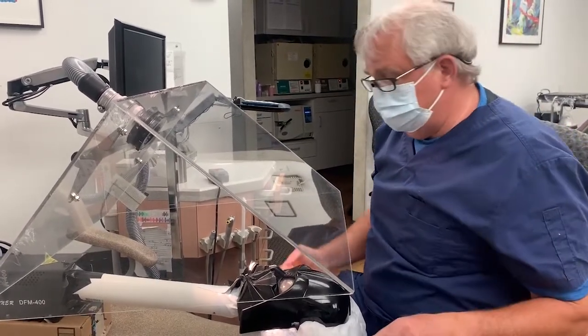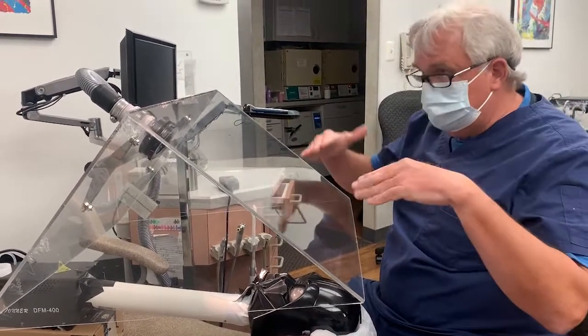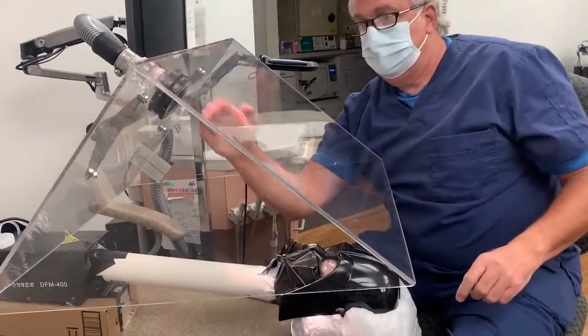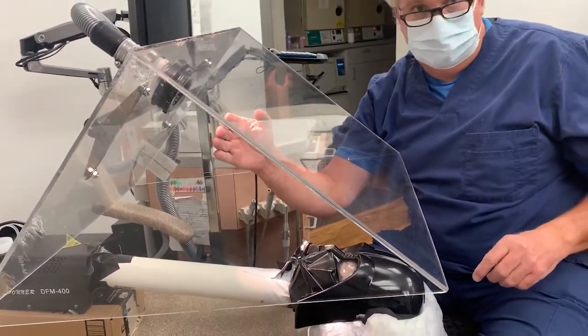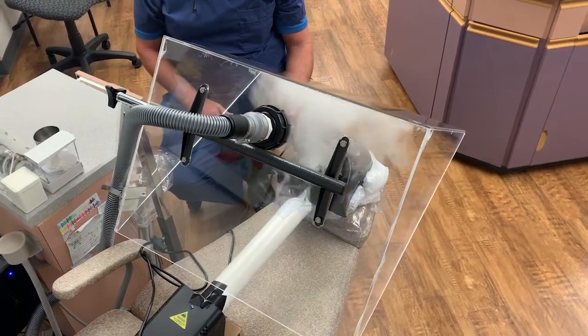So that's two things. Three: you worry about splatter. Some of the other things that are sitting flat are right over top of the patient's face. Look at the distance between here and here — that's a tremendous amount of distance. I don't think they're going to get any splatter at all. And if anything, the suction right here is kind of drawing everything into it.